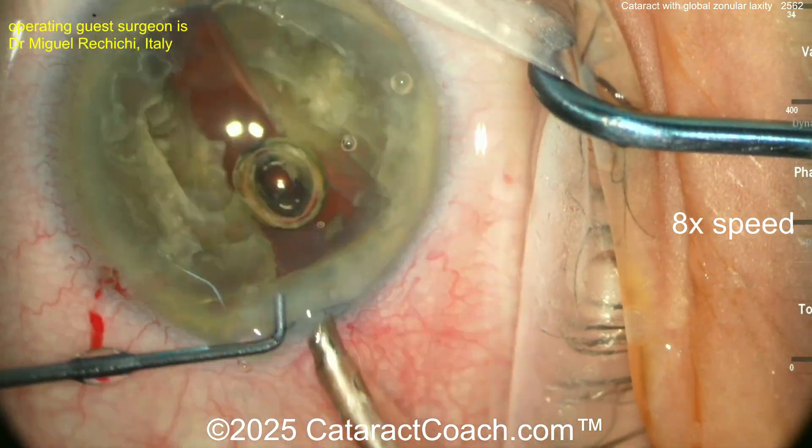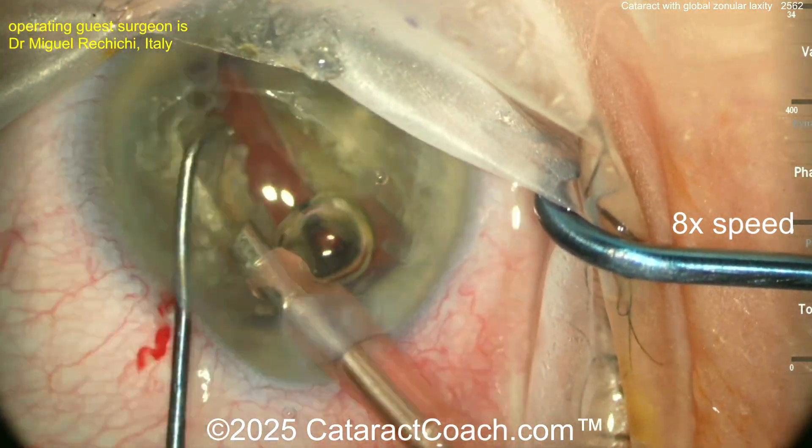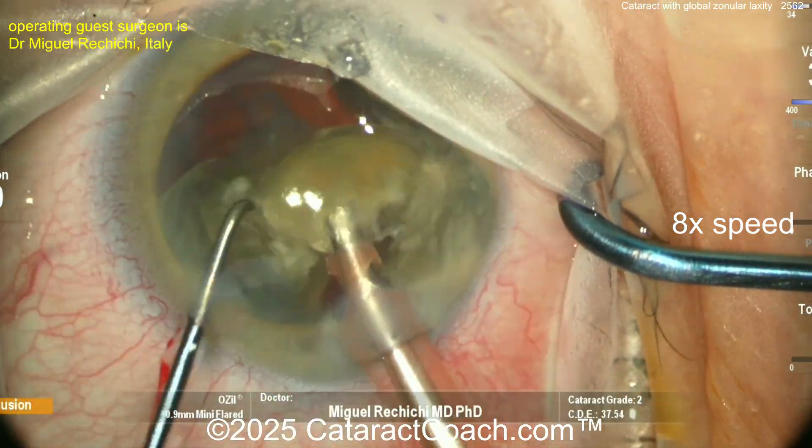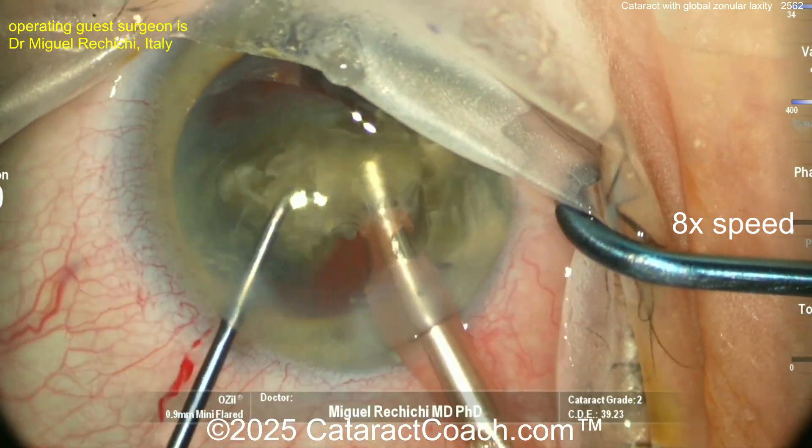Our guest surgeon just added extra viscoelastic to protect the cornea, and now we have two halves. At this point you can certainly chop each half — stop-and-chop technique here. We've sped the video up just to be efficient.